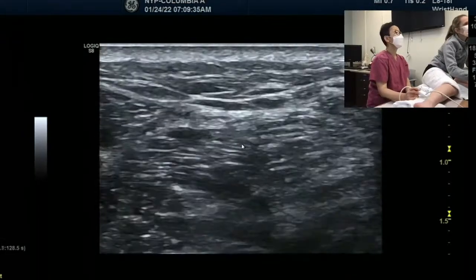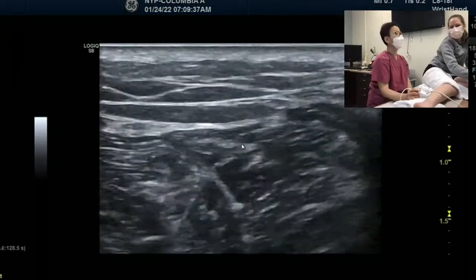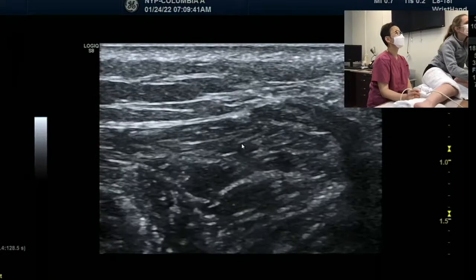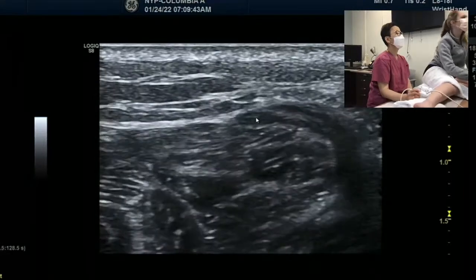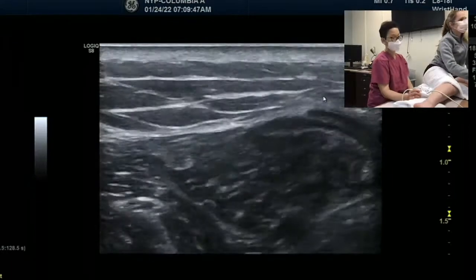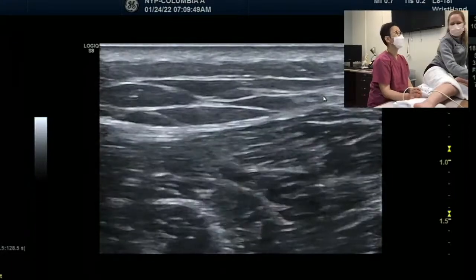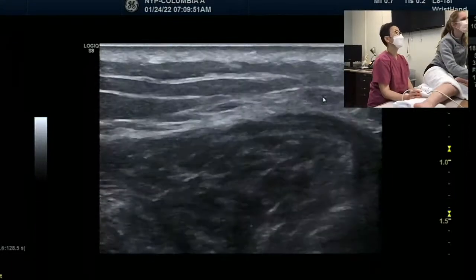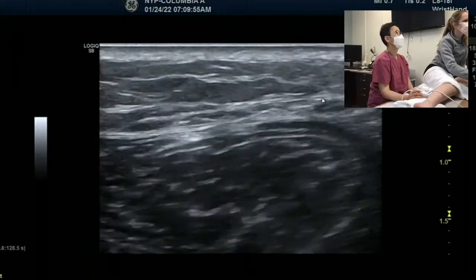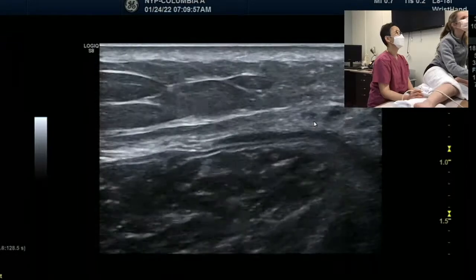14 centimeters over here, almost, right? Do you see? Where is it, Debbie? All the way to the right side, that one. So you put it here, and then you put your probe and do a nerve conduction study to find out the sensory action potential. And then I'm gonna go up, up, up.